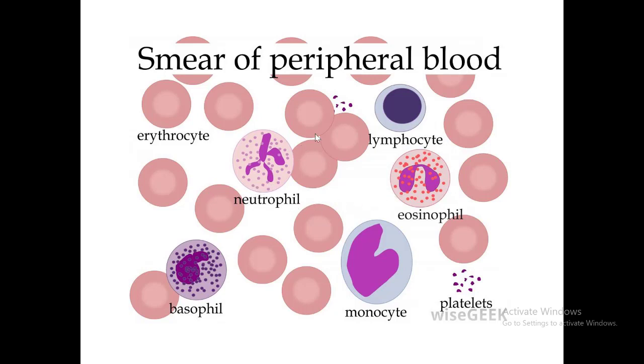And after neutrophil, the most numerous cells are lymphocytes, mononuclears. Lymphocytes are the same size as one red blood cell, and they have a prominent nucleus occupying most of the volume of the cell, with a rim of cytoplasm, a thin layer of cytoplasm surrounding this nucleus, and the nucleus is heterochromatin and dark blue.